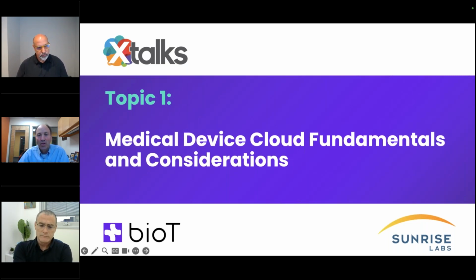In terms of the architecture of the device itself, in general, we're trying to build the simplest device you can, like Daniel said, and sometimes that's a minimum viable product, and you would architect it to have the capabilities you need to be able to expand in the future. If that's algorithmic, for example, and you're doing things that you really can't do in a device, uploading it to the cloud is a good thing.